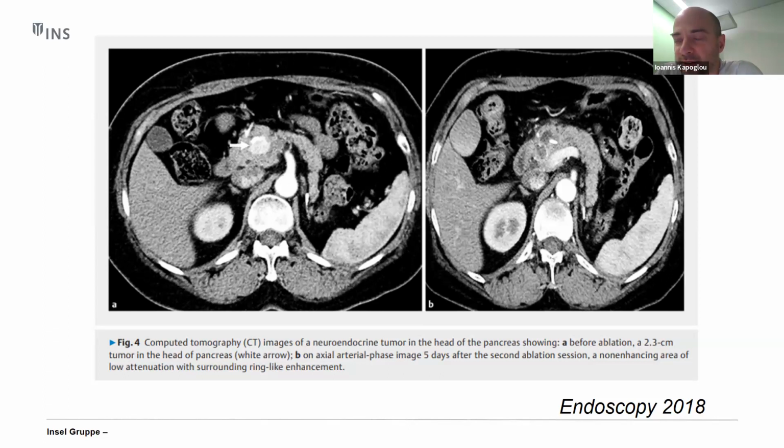Man würde die Kontrastmittelaufnahme erkennen können, falls da eine Restläsion da wäre, insbesondere bei den NETs natürlich. Beim Adenokarzinom würde man schauen, ob die hypodense Struktur im Verlauf weniger wird oder nicht. Aber MR bleibt nach wie vor der Goldstandard für das Follow-up.